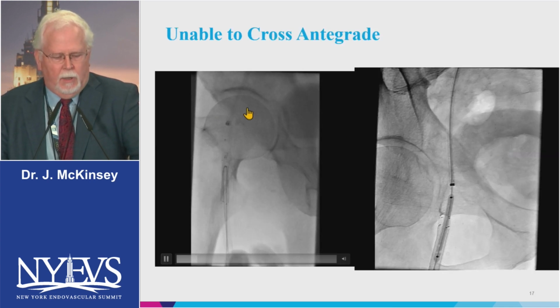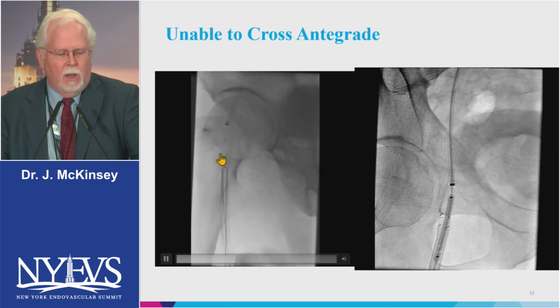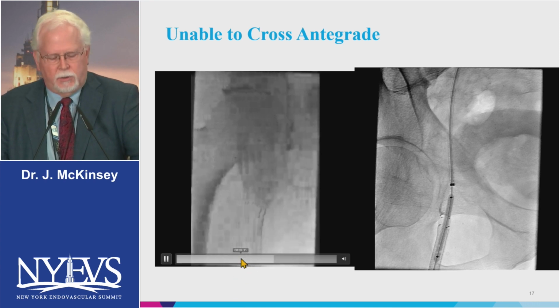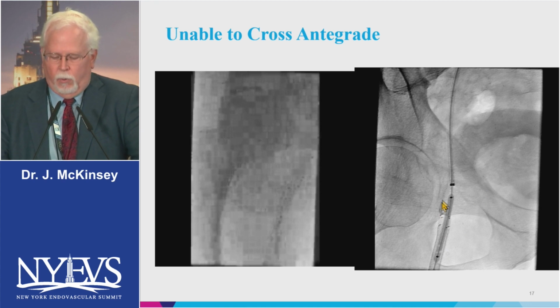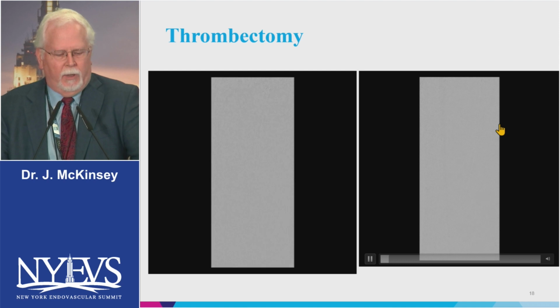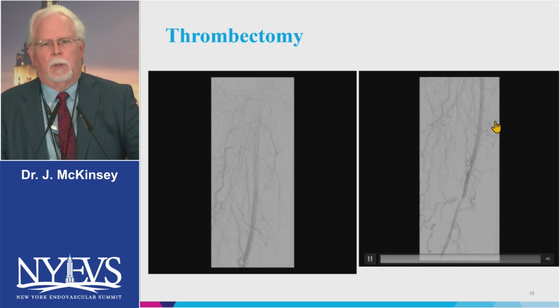We originally came in and could not engage through the proximal aspect of the stent. It was very hard there. So as Dr. Schmidt was just showing us, we accessed the stent distally and then came up. We did use the balloon to help orient as we came through once we had through-and-through access. And then with that, we came in and first did thrombectomy. And this is the luminal gain I got just with blades down.